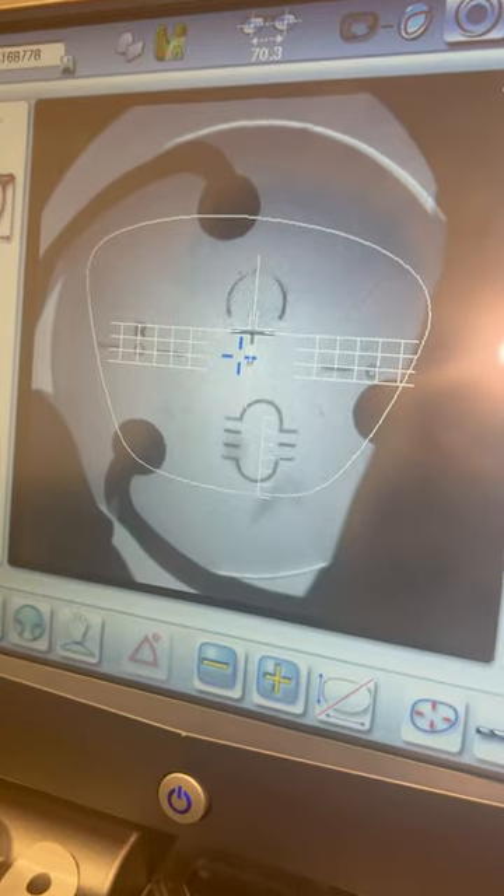Then he's going to put the lens in the scanner. For this lens, the optician had to manually map out the lens.